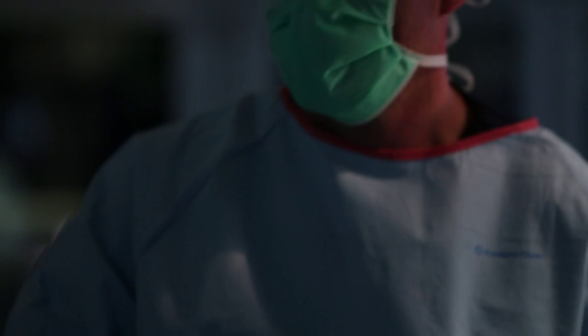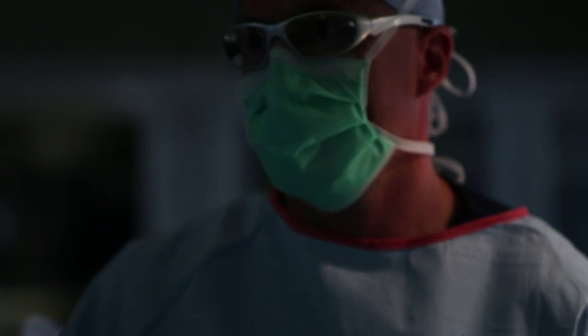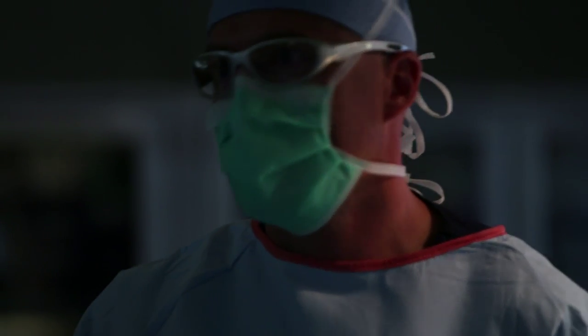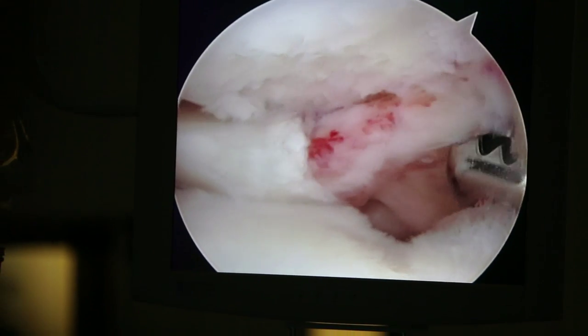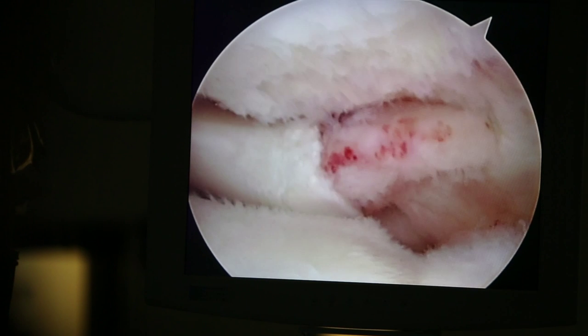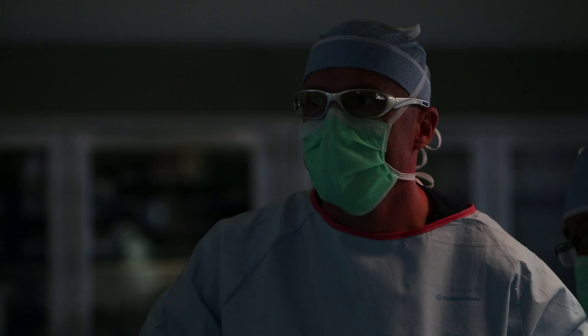One of the benefits of arthroscopic surgery is that the video image is magnified, so we can get a really good idea of the fine detail of the structures inside the knee.